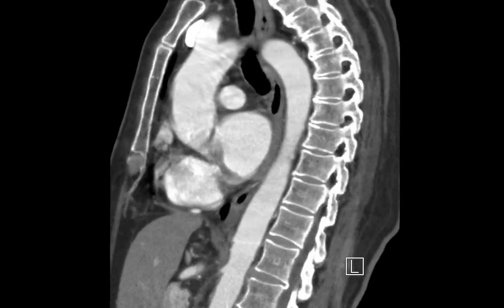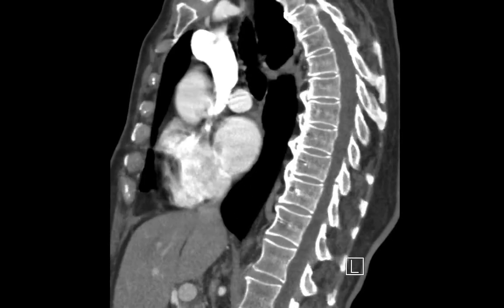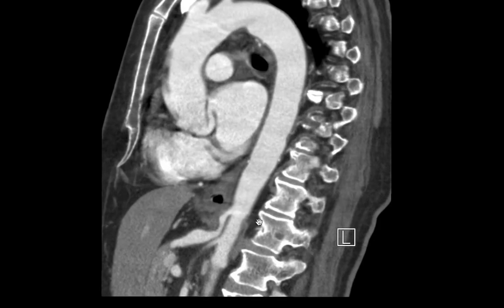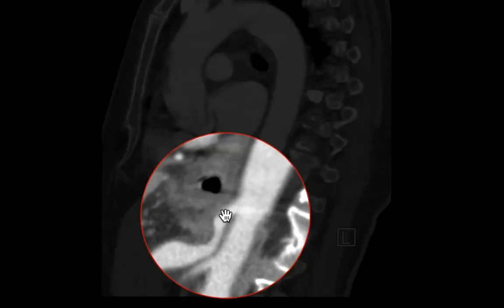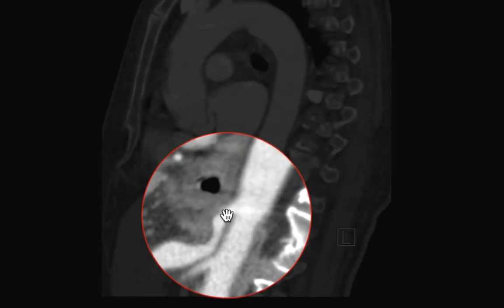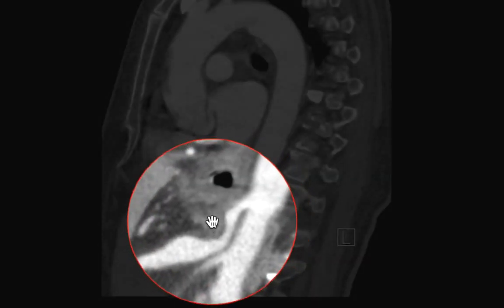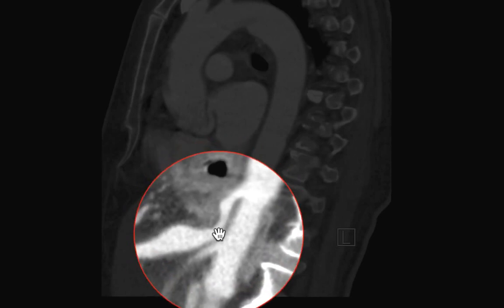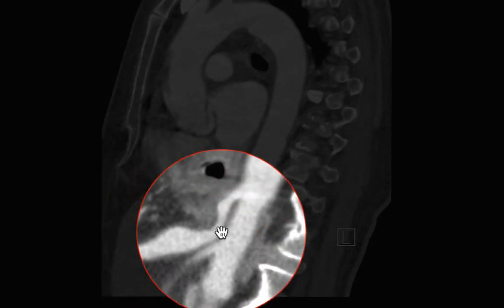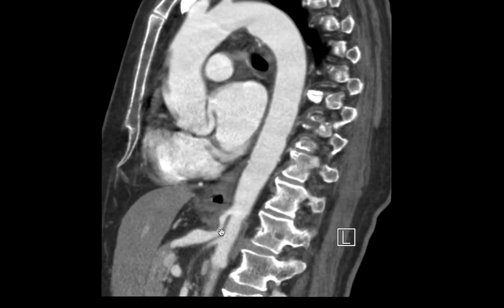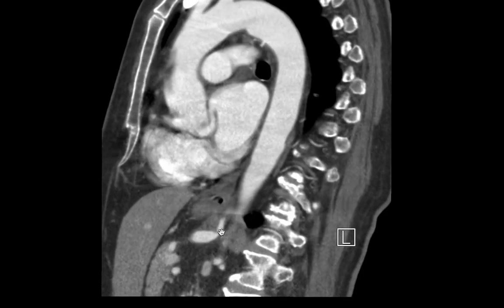So let's look together at the sagittal reformats. It is much easier here to appreciate the proximal stenosis of the celiac artery and the post-stenotic dilatation, and to notice that the stenosis is actually caused by a soft tissue density that crosses from side to side.